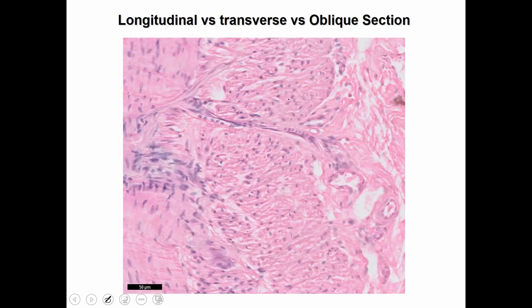So here is a section. And if I look at this, a lot going on here, but you can appreciate that right here, here's a cross-section of vasculature. You all see that? Okay? So immediately shown here. Now, is there any other profiles of vasculature? Well, this also looks like maybe a cross-section, or it's starting to be an oblique section in between longitudinal cross-section.